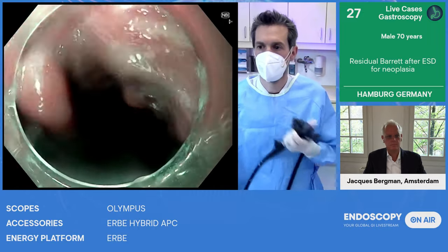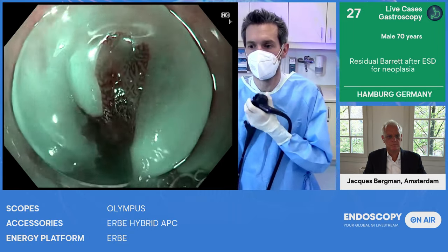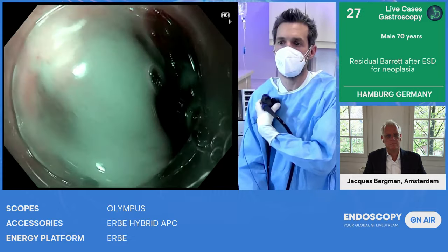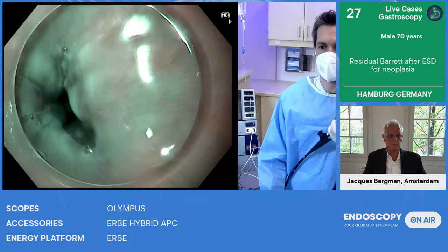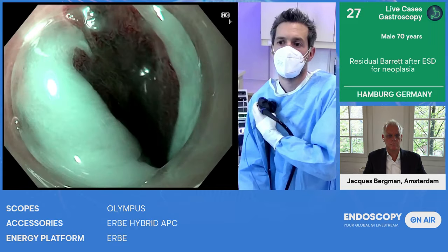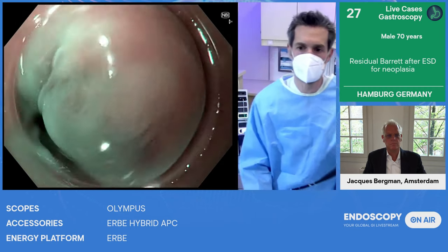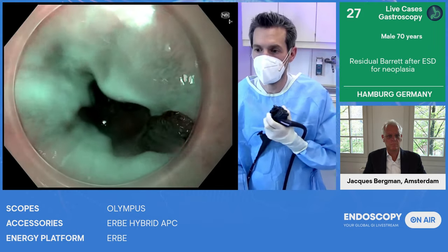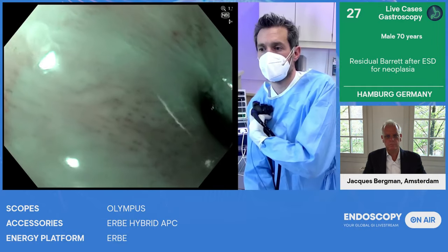And as you all know, it's not always very easy to decide whether this is just gastric mucosa or really Barrett's esophagus. This is the one area we have to think about. And then this is the second small area right here. Because of the ESD, he has slight scarring on the right-hand side. And to get a proper position on the end of the scar is not so easy, as you can see. But there we have this small island. And we took biopsies within the last gastroscopy, which showed that on the 3 o'clock position on the right side, there's residual Barrett's esophagus. So this is the area we are going to treat today.